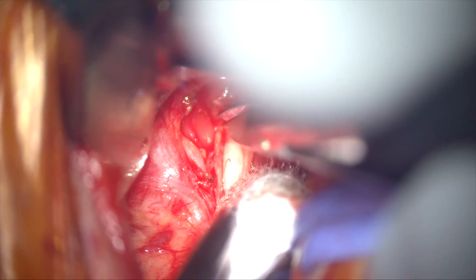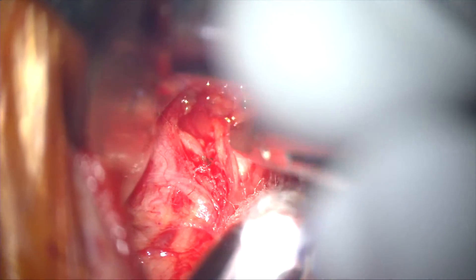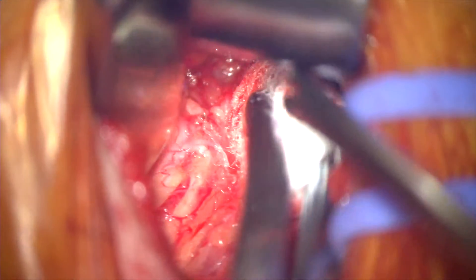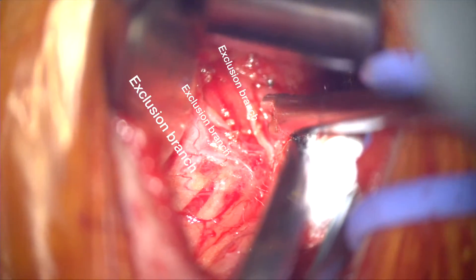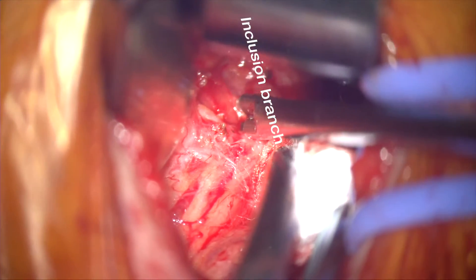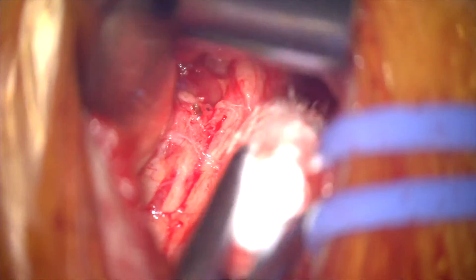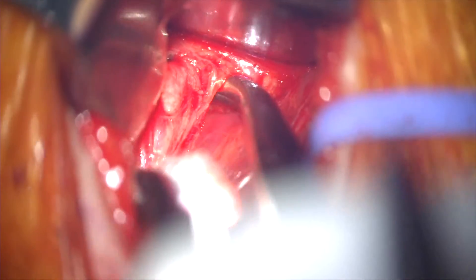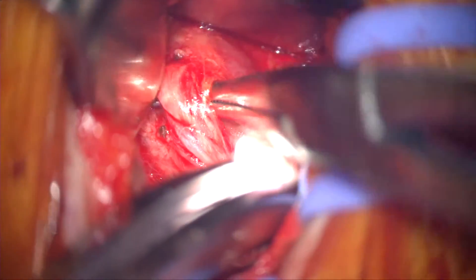So now we can see that small branch is outside of the main nerve branch to the genioglossus, and we're going to next dissect around it so that we can place the stimulation cuff around the main branch to the genioglossus muscle. We've stimulated the main genioglossus inclusion branch and the small branch that we'd like to have excluded, and we've dissected that free. Now we're placing our McCabe retracting dissecting device from an inferior to superior direction to get under our branch for stimulation and to create a pocket for the stimulation lead to wrap around the nerve.